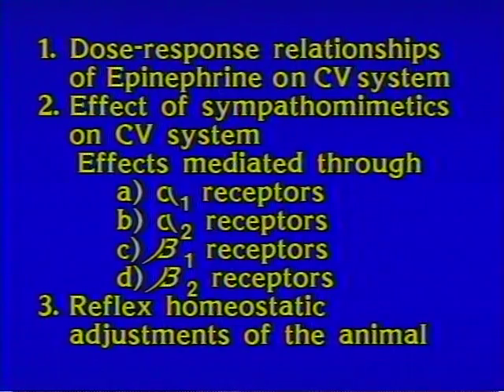The subject of today's laboratory demonstration is the study of adrenergic agents on the cardiovascular system. The objectives are as follows. First of all, to examine the dose-response relationships of epinephrine on the cardiovascular system.